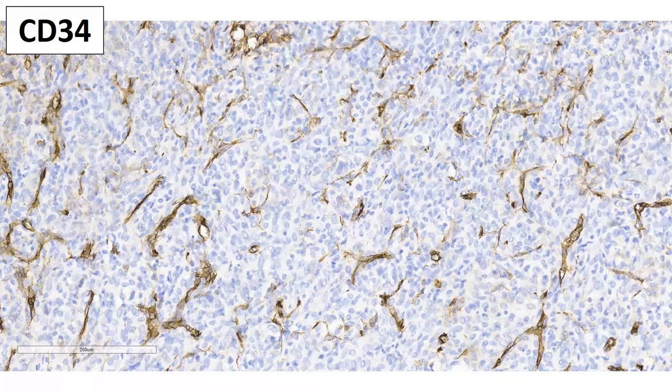It highlights the vasculature when sometimes you can't see it on H&E so clearly. Now, CD34 is also important. The reason why we used it historically is because in solitary fibrous tumor grade 1, which is the historic old solitary fibrous tumor, it tends to be strongly diffusely positive. In the old hemangiopericytoma or solitary fibrous tumor grade 2 or grade 3, it tends to be only patchy, sometimes stone cold negative. All right, that's what we said in the old days.